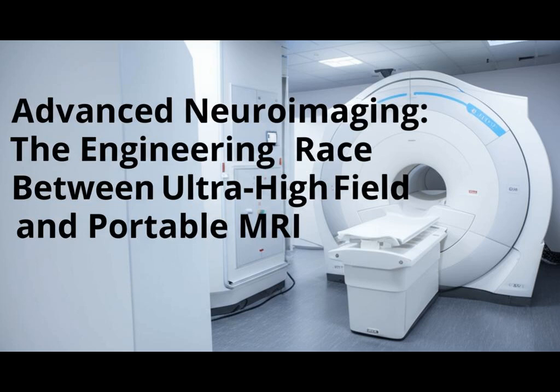So is it a race where one technology wins? Not really. UHF and portable MRI are pushing engineering boundaries towards different, equally important goals. Ultra-high field MRI seeks the ultimate anatomical detail, powering advanced research and specialized diagnostics. Portable MRI champions accessibility, bringing vital imaging capabilities directly to the patient wherever they are. Both paths are advancing rapidly, with improvements in hardware, software, and AI continuing to enhance both high-detail imaging and point-of-care solutions. Ultimately, they represent complementary tools, expanding our ability to understand the brain and improve healthcare, whether by revealing its finest secrets or making essential imaging available to all.